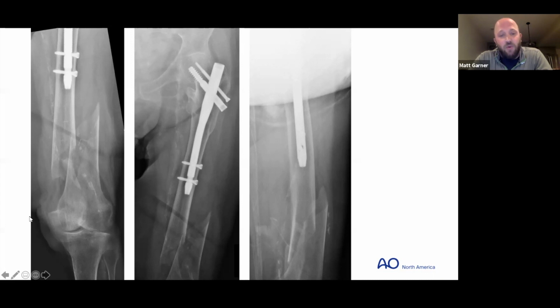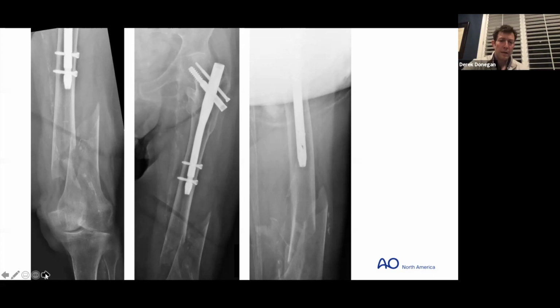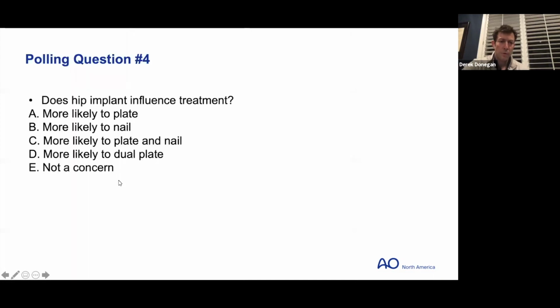If they're not able to tolerate that, I would probably go with some form of laterally based plate distally. I trained on this, it's not something I buy into completely, but if you really want to have intramedullary augmentation, a fibular strut or a medial endosteal plate could be helpful, but then you're going to have to overlap the existing intramedullary implant proximally.